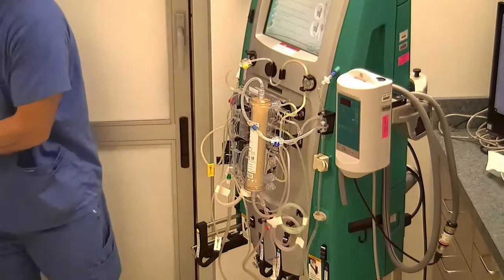This is a safety feature. We always want to keep this at the default at 400 mLs per 3 hour period. This is just stating that your patient will neither gain or lose 400 mLs of fluid in a 3 hour period. So just leave it where it's at, 400, and hit confirm.